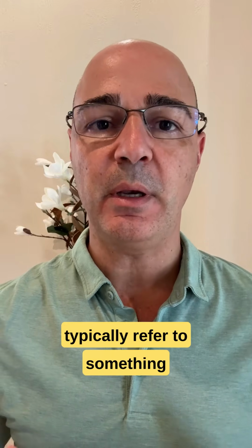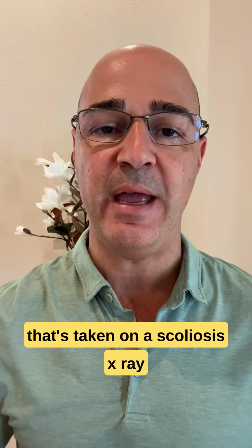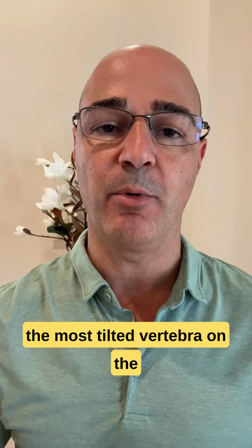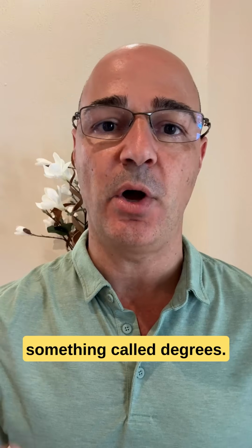Scoliosis measurements typically refer to something called a scoliosis Cobb angle. And a Cobb angle is a measurement that's taken on a scoliosis x-ray that's comparing the most tilted vertebra on the top of the curve to the most tilted vertebra on the bottom of the curve, comparing these two tilts and expressing the severity of the scoliosis in something called degrees.